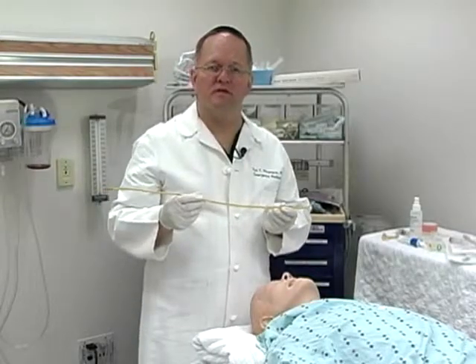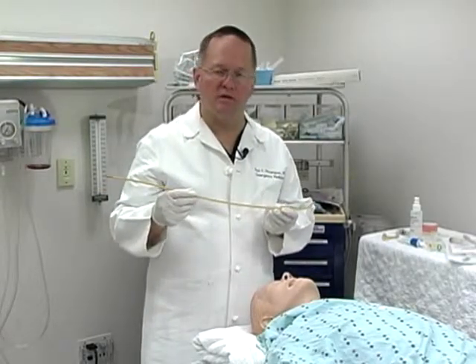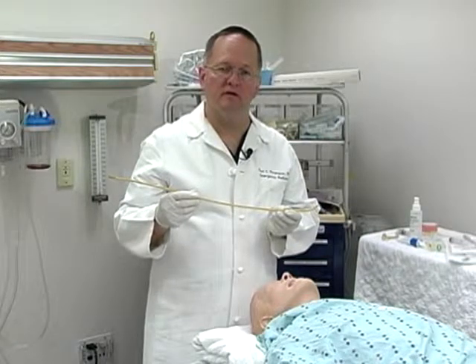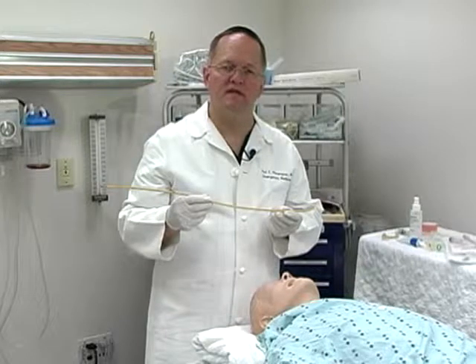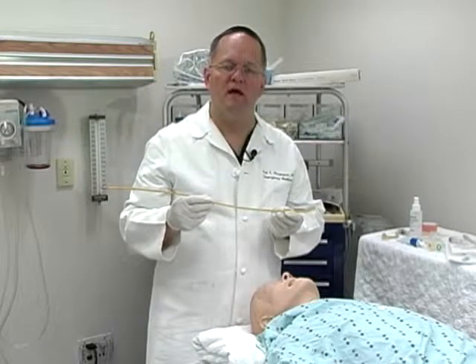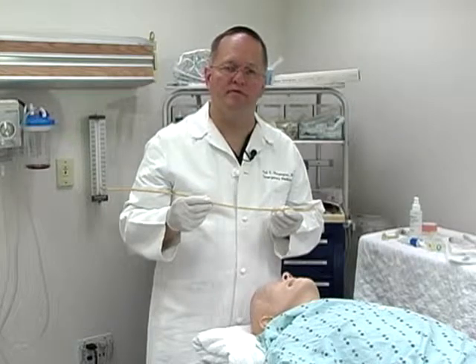The purpose of this short video is to describe the use of the gum elastic bougie, or gum bougie, in the oral tracheal intubation attempt. It is best utilized when complete visualization of the vocal cords cannot be obtained. However, there are identifiable landmarks when you are looking in the posterior pharynx.